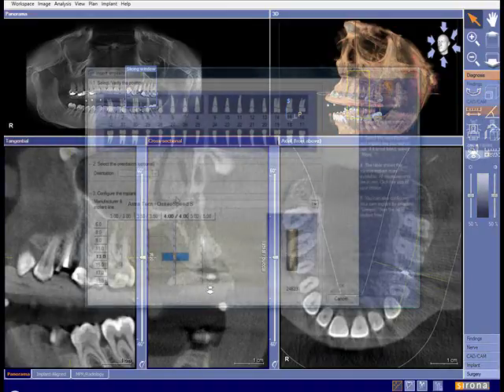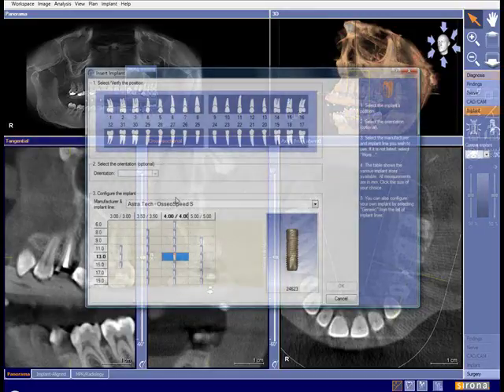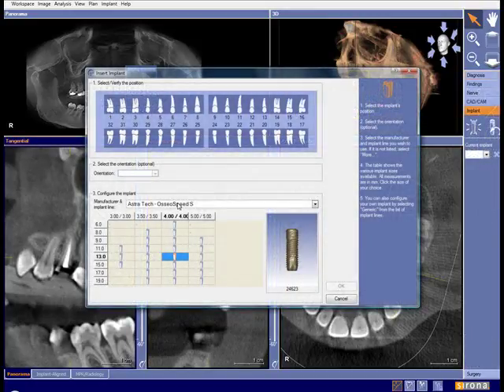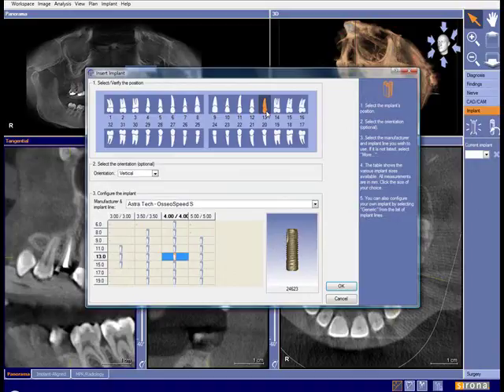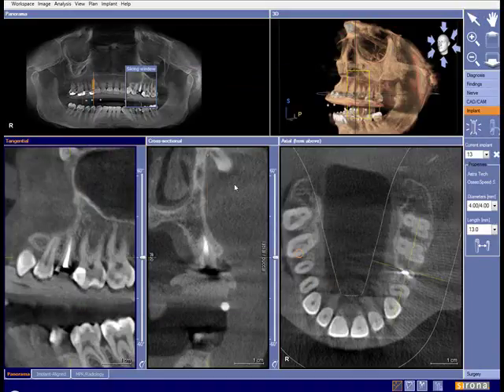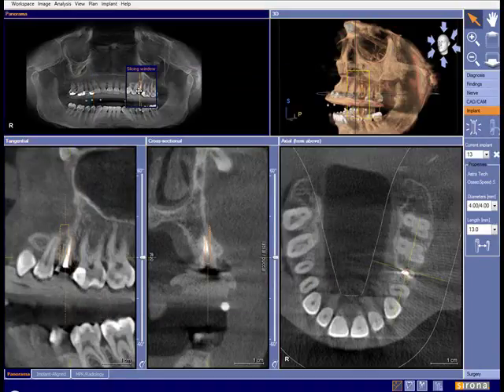We have enough bone there in terms of thickness and we have enough height. Now I'm going to digitally design my implant. I'm going to take an implant and place it right into the area where that missing tooth is.